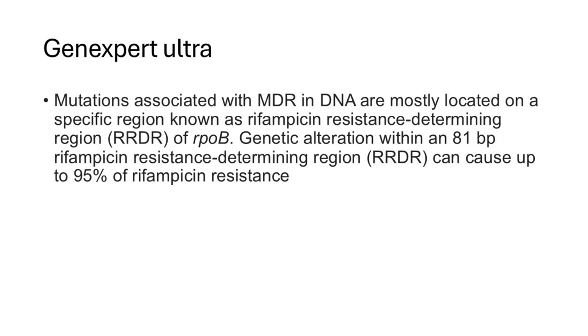So to overcome that problem, the Genexpert Ultra was developed. What it does is, you have these specific mutations associated with MDR in the DNA, which is located on a specific region known as the rifampicin resistance determining region of the rpoB. And because these additional copies are inserted into the Ultra, you get a better sensitivity.